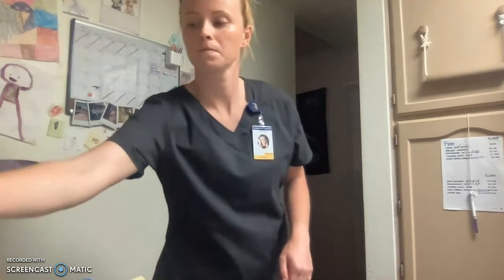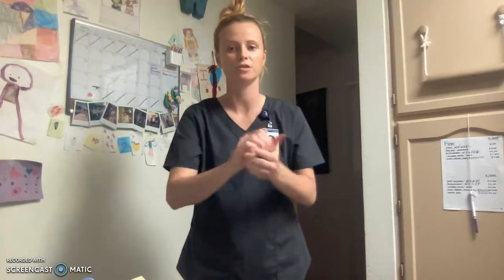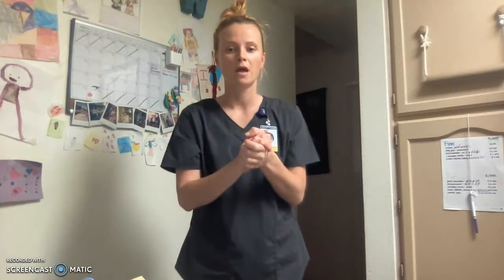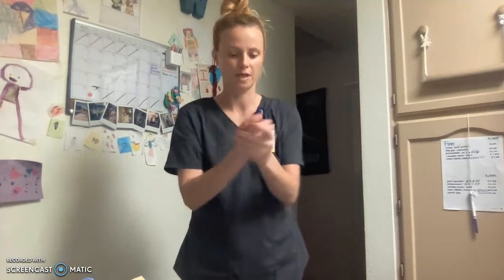First, hand hygiene. Ensure that I rub it in appropriately. In the real world, it would be preferable that we would hand wash, due to some patients being immunocompromised. But for the sake of this video, I'm going to use hand sanitizer.